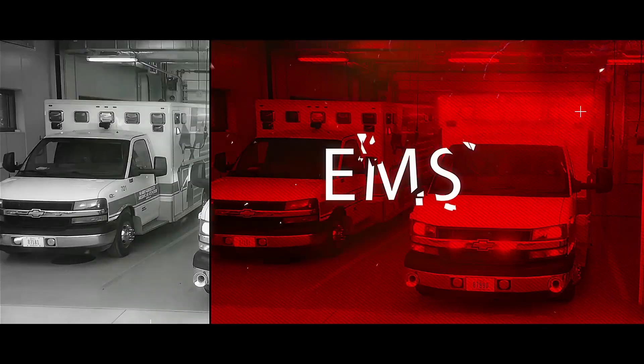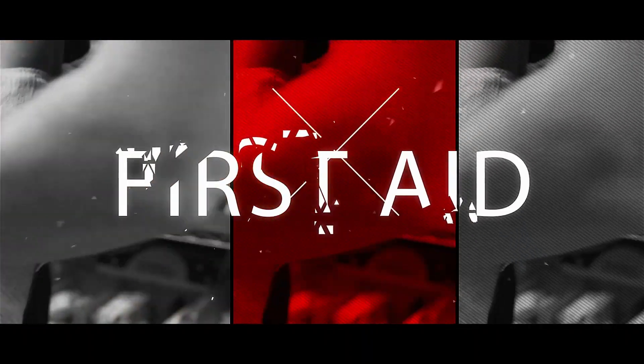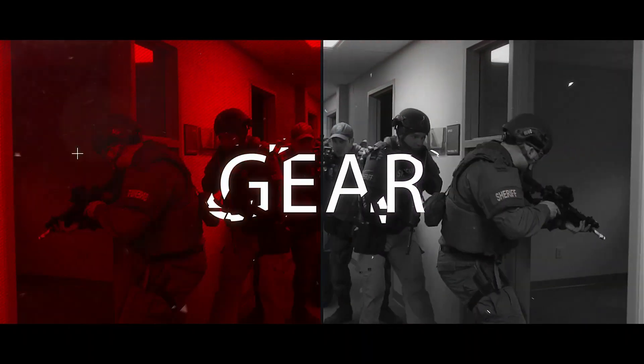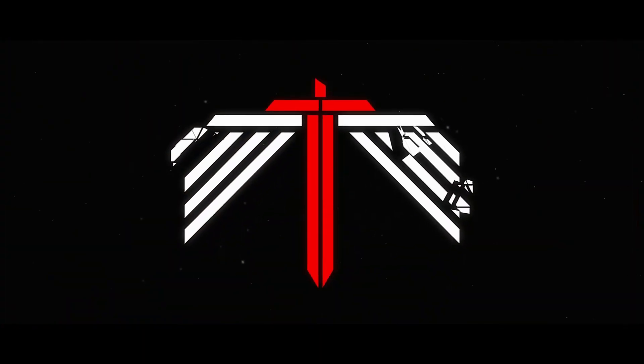This week's video, we're talking about taking off tourniquets. This procedure is called a tourniquet conversion.